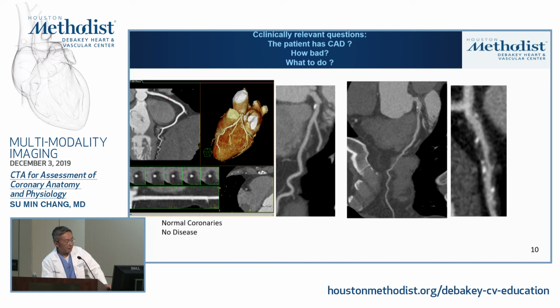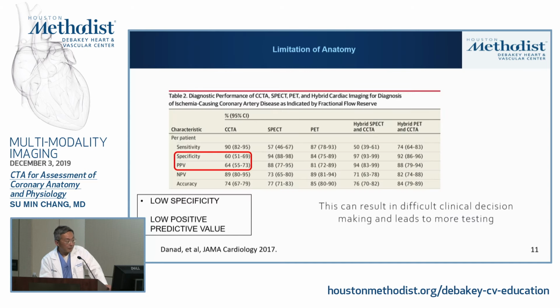You're born lucky. And the one on the right has minimal disease, but it's disease. It doesn't need revascularization, but obviously needs optimal medical management. On the right-hand side, the patient with significant extensive disease needs optimal medical therapy plus possibly revascularization, depending. Okay, and again, this is not surprising to you guys.